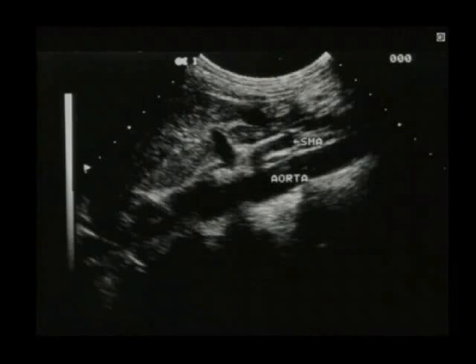The SMA will come off, and it travels in that exact direction. But it is not important that you identify the SMA or the celiac axis. That level of aortic ultrasound is not what we're doing here. We just want to know, do we see the full aorta, and is there an aneurysm?